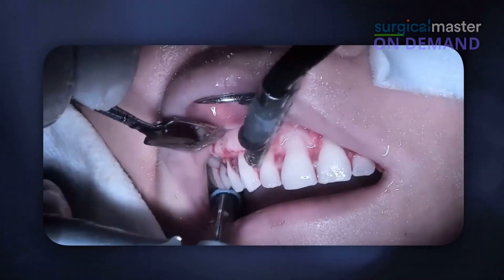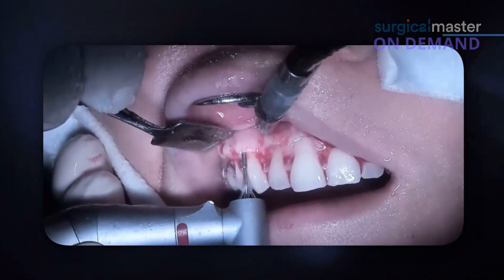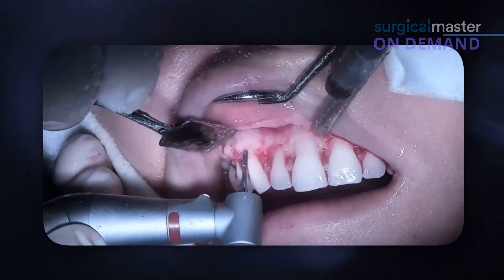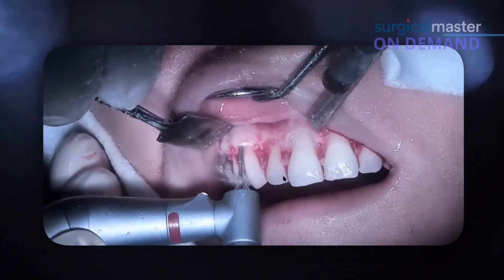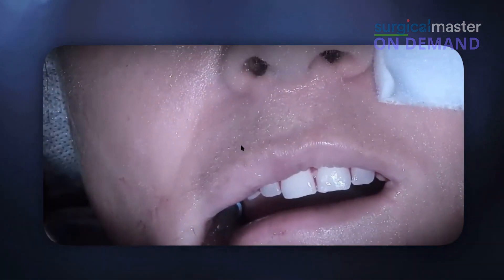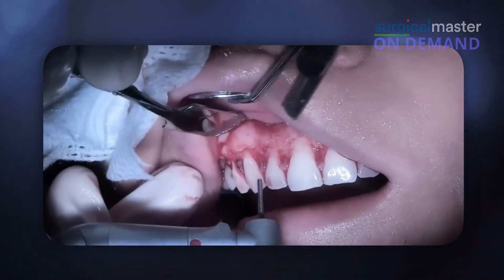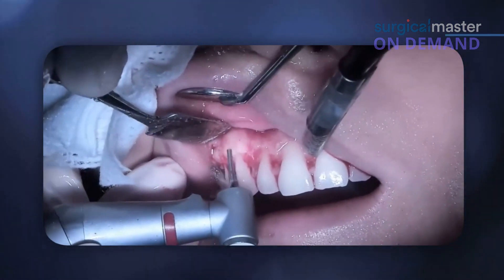This bur creates so much water and spray — nowadays we use aerosol suctioning devices. Now, if the water doesn't hit the edge of the bur, take a look — it becomes kind of dry, and what does it do? It overheats the bone. So I stopped — I think I changed the bur or changed my electric handpiece.